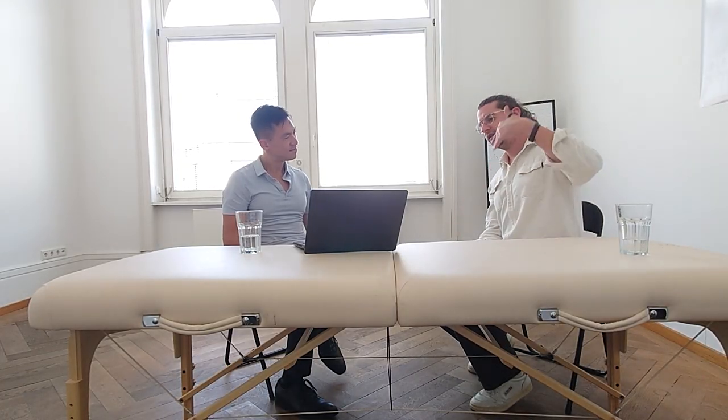So we use the individual body limits to create this MVA. And the higher this activation is, the more the athlete is communicating with the muscle in the daily routine. And so when someone is coming to me and telling me that he is playing football 5 times a week, I want to see a high activity of the gluteus medius. Because I know the gluteus medius is a really important muscle integrated in these running procedures.